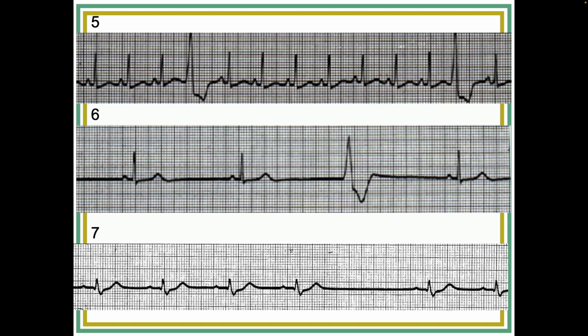You know, everything you're saying is right, and in all honesty, we're splitting hairs, because I still stand by the idea that if you think of what the real difference between premature and escape is, it's not necessarily what you see on the ECG strip but the underlying mechanism. In this case, I'm pretty confident that the ventricles are made irritable because they're not receiving the depolarization.